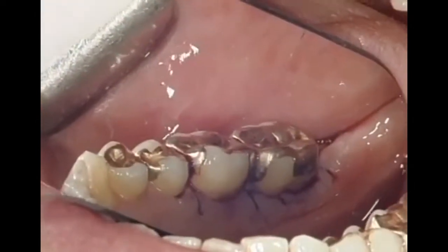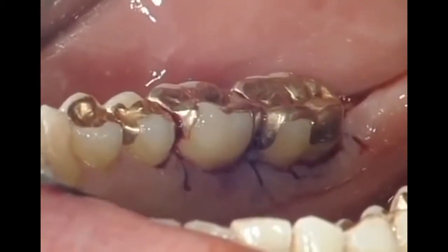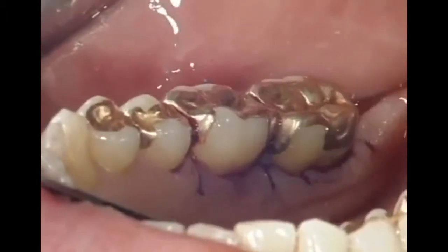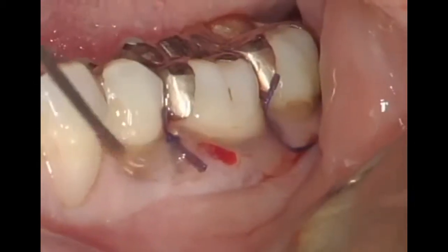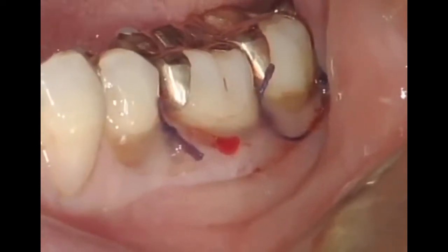The final view shows a well-adapted, tension-free gingival margin. Clinical experience shows that the application of the remaining Emdogain to the sutured wound margins can improve wound healing.